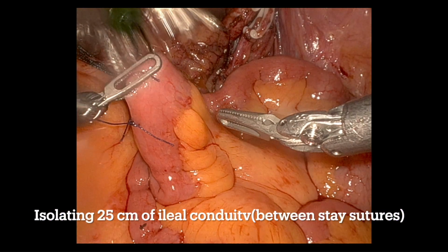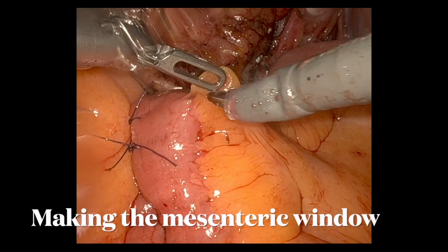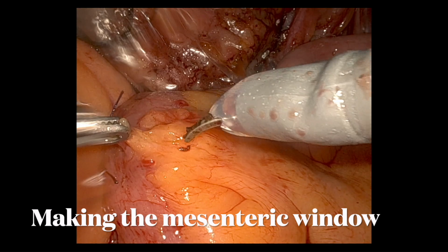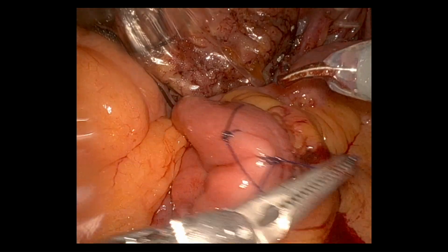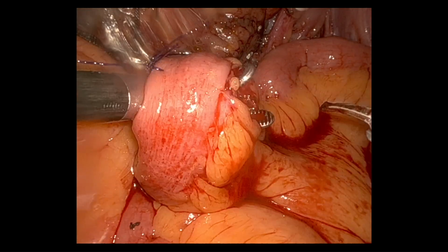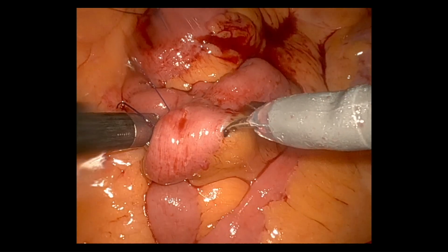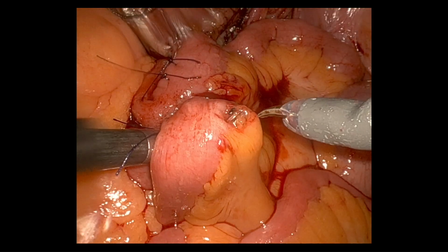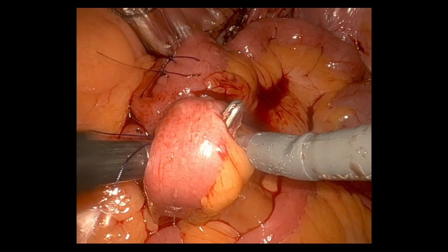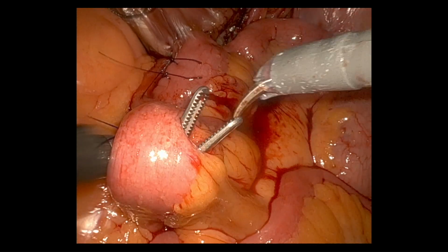We begin by isolating a segment of distal ileum for the ileal conduit, 25 cm from the ICV junction. We use two stay sutures 25 cm apart. Next, a mesenteric window is developed at the distal end of the segment, followed by one at the proximal end at the stay suture site.